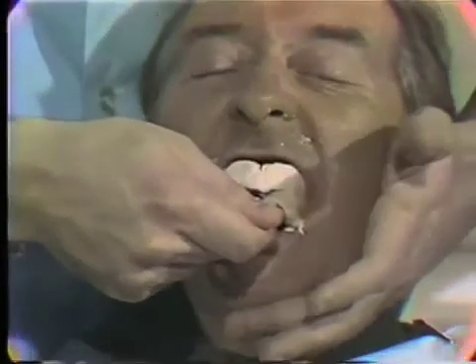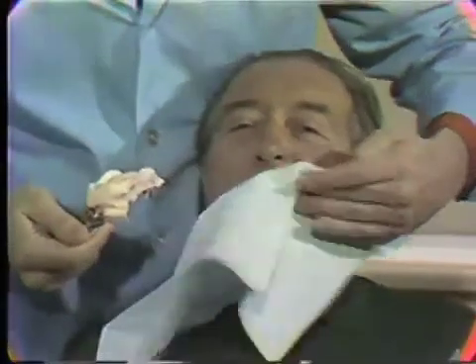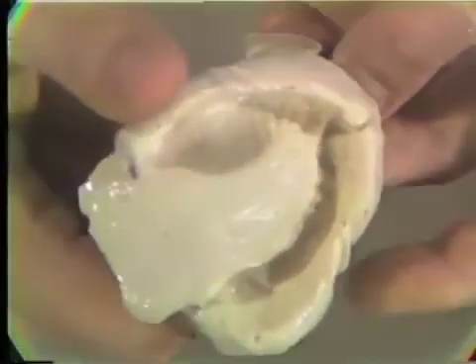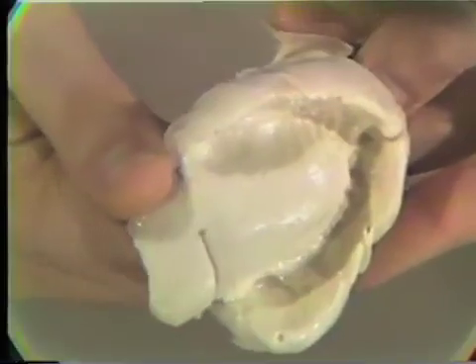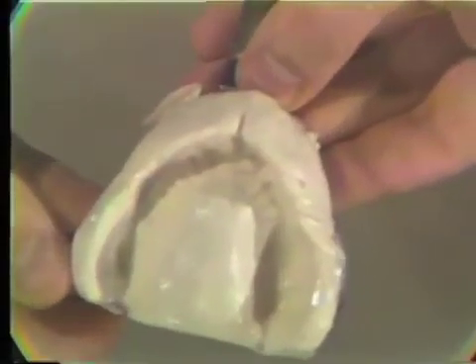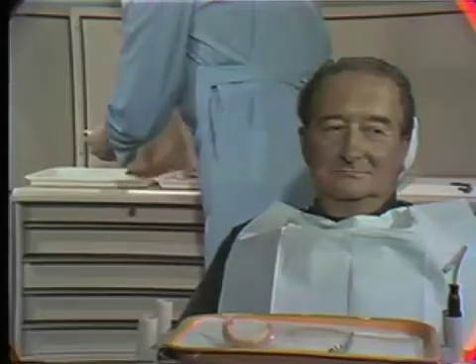The impression is next inspected to ensure that the landmarks and peripheries have been adequately recorded. The tuberosities and hamular notches should be identified bilaterally. The buccal and labial flanges should be identified bilaterally, and the buccal and labial frena should be visible. Often the fovea palatinae are distinguishable at the posterior border. Material distal to the hamular notches and fovea can be removed. In order to preserve the accuracy of the impression prior to pouring in stone, it is covered with a wet paper towel.